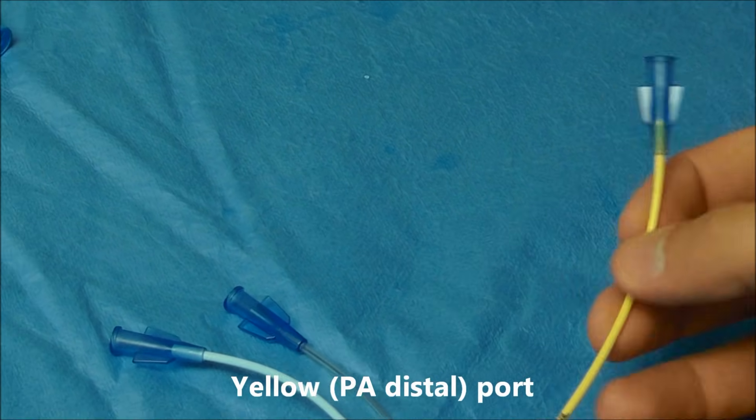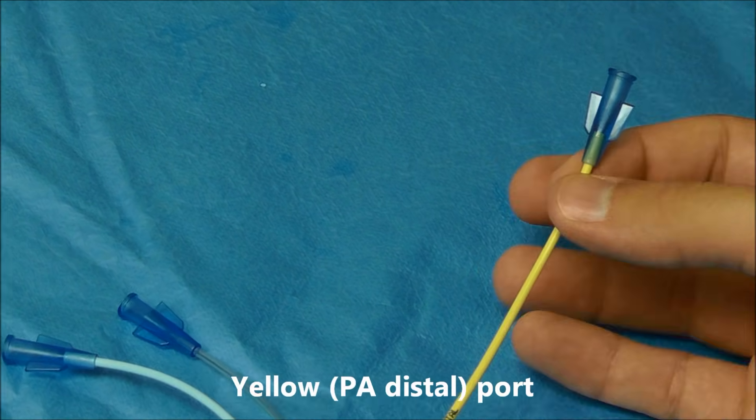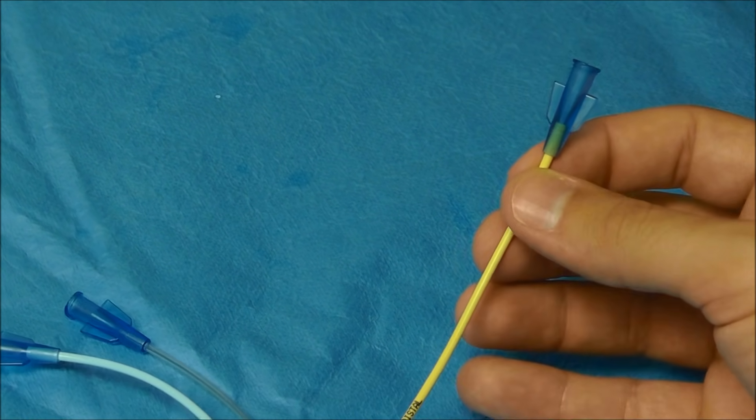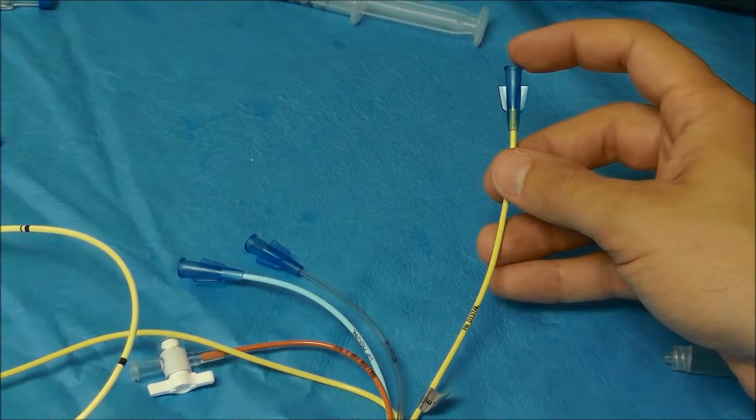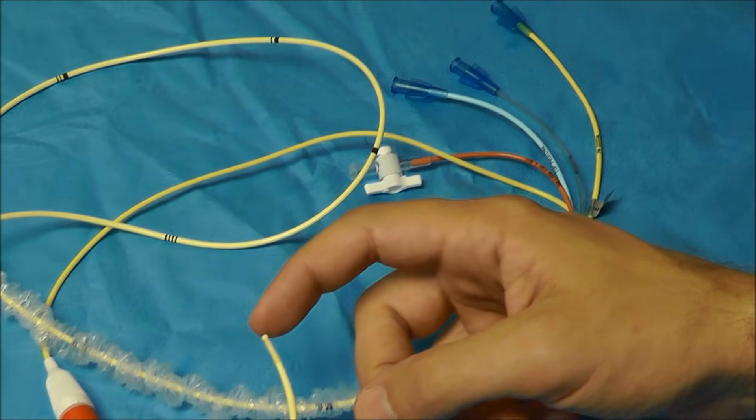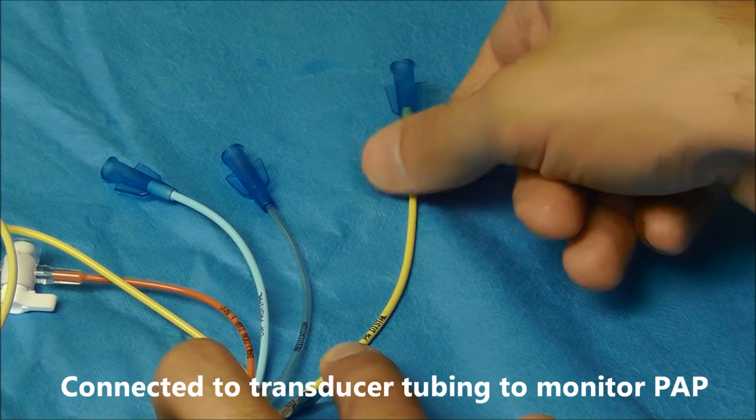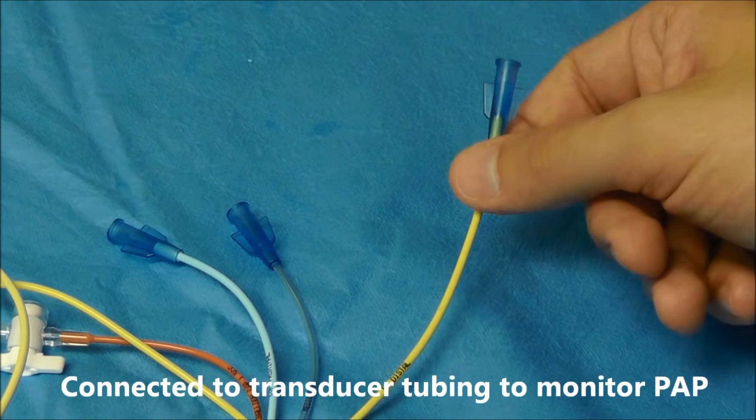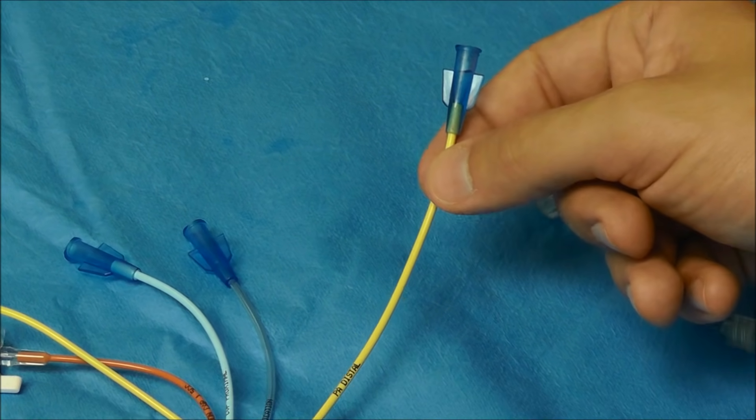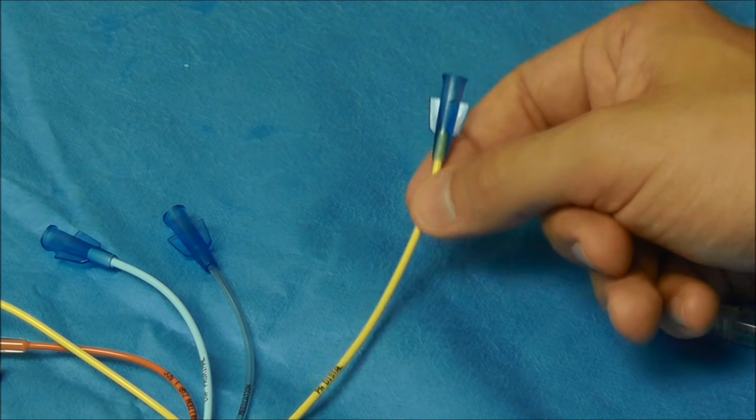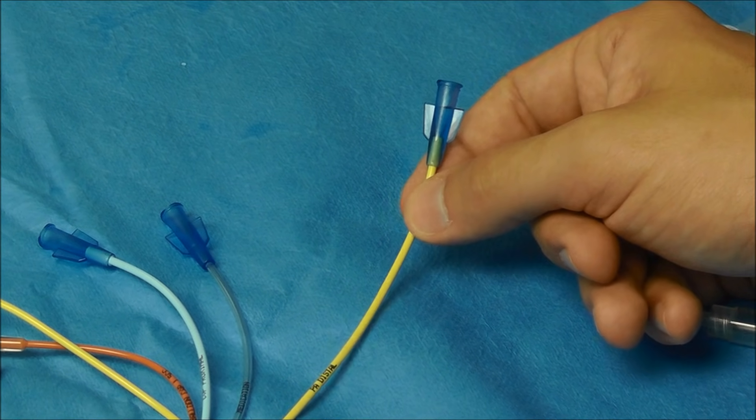The yellow port is always called the PA distal port. And what this means is this lumen here goes all the way to the distal tip of this catheter. The connection to this yellow port is you're going to connect transducer tubing. And the purpose of that is you're going to use that to monitor pulmonary artery pressure and wedge pressure.